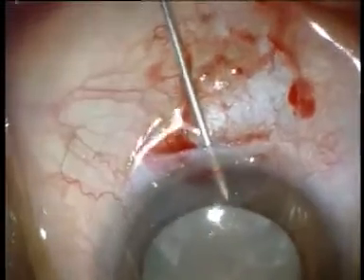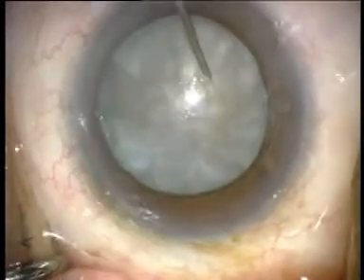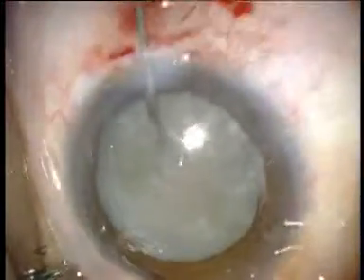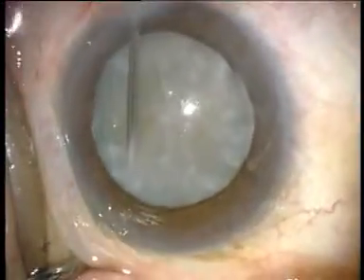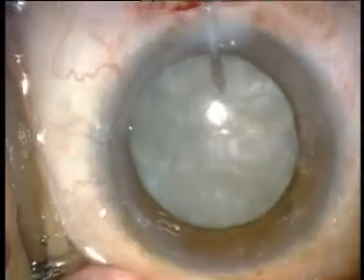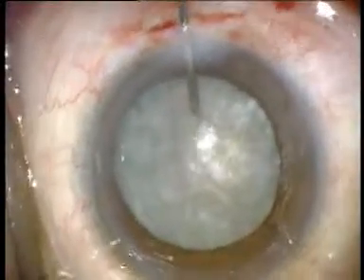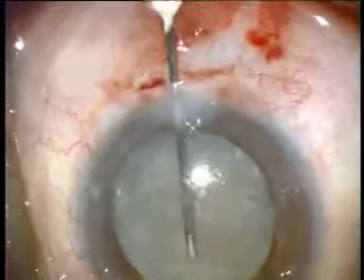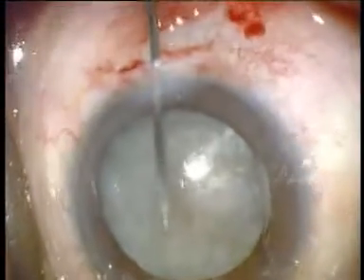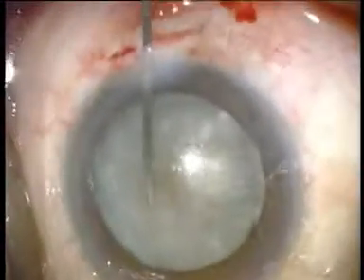At this point, before the anterior chamber is entered, a capsulotomy is performed. The bevel of a 27-gauge needle attached to a syringe containing Ringer's lactate is used like a knife to make 2 incisions with fine chopping motions in the anterior capsule. Thus, a triangular flap of anterior capsule, still attached at its base, is created. The apex of the capsulotomy is stripped inferiorly with the tip of the needle.